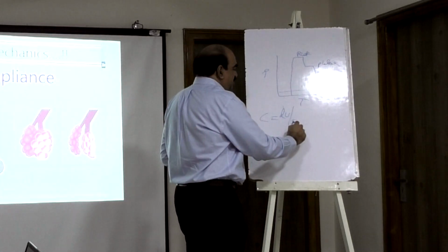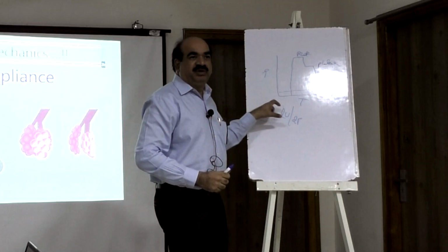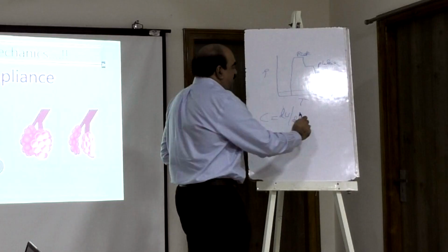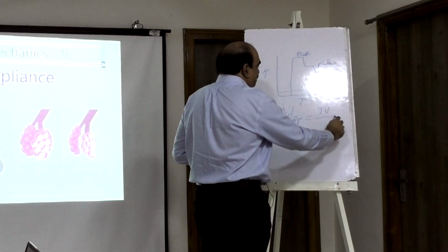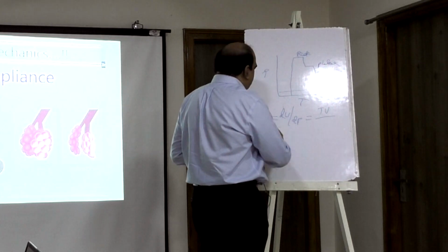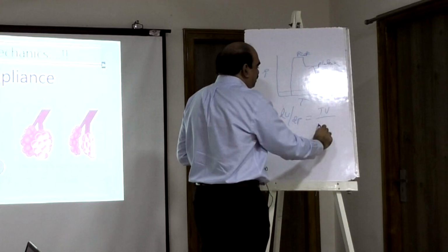Volume by volume change in volume per unit pressure change. Change in volume is tidal volume. Change in pressure for static compliance, CS, is P plateau minus PEEP.